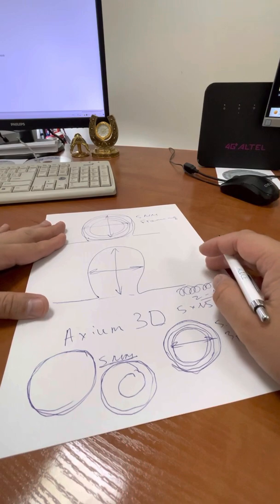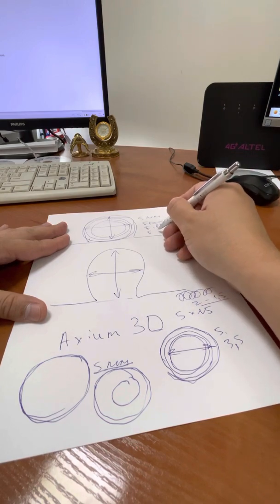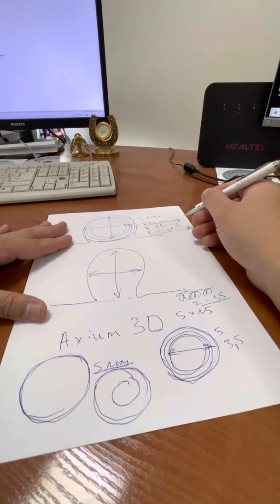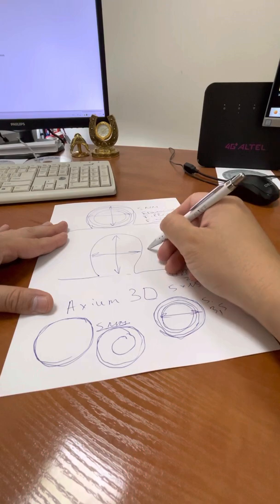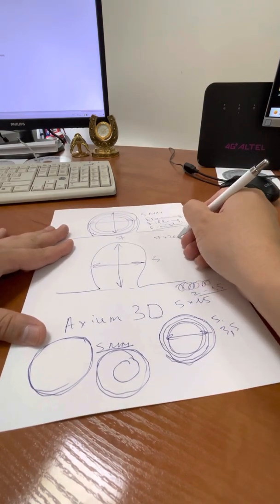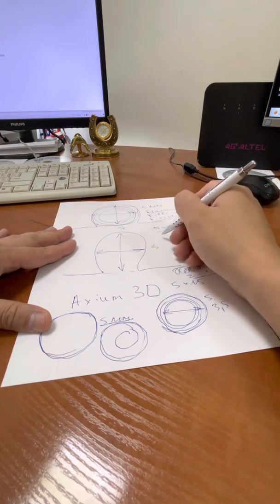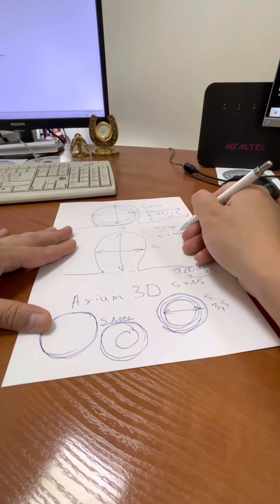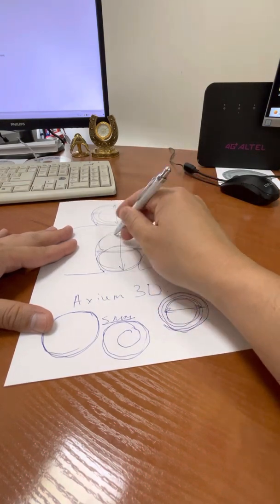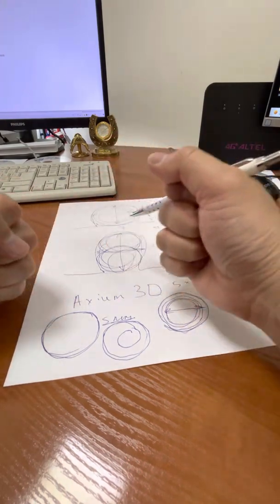And with other manufacturers, you need to see on the box if it's a frame or filling or finishing coil. It's very important because the finishing coils are softer and the framing coils are stiffer. In such kind of aneurysm, 5x7, if I start with the Axiom coils, I will take 7x20. If I start with my conventional Balt Optima coils, I will take 5 millimeter because it could be quite stiff, and it will feel like this and like this. I would not take the 7 millimeter in such an aneurysm because it would be stiffer and could rupture the aneurysm.